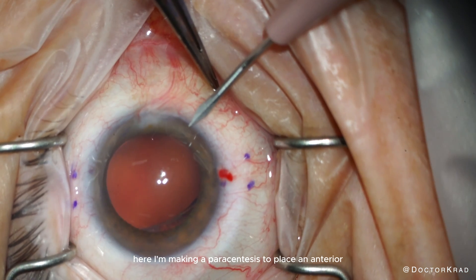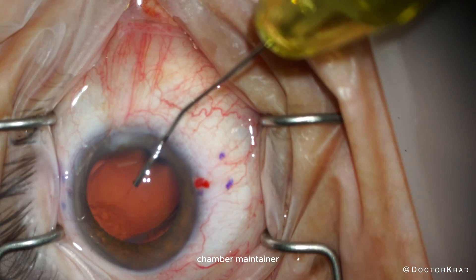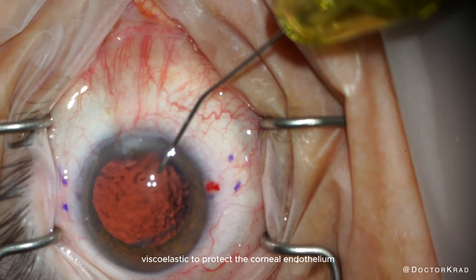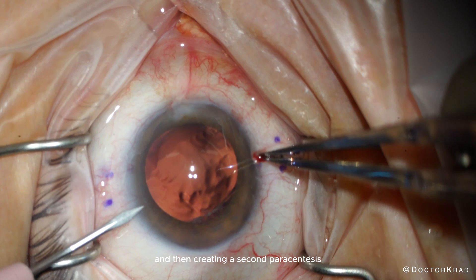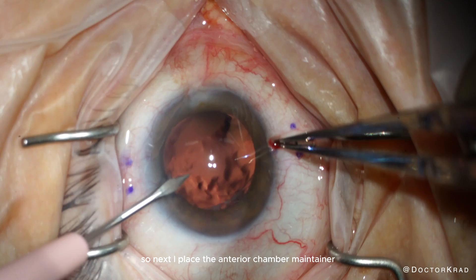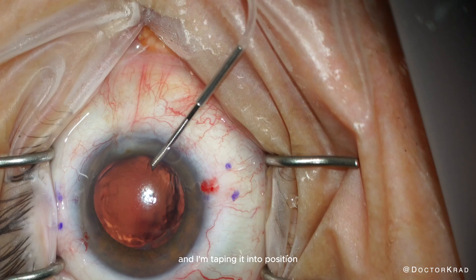Here I'm making a paracentesis to place an anterior chamber maintainer. I'm injecting some viscoelastic to protect the corneal endothelium, and then creating a second paracentesis to give me a different angle of access into the eye. Next, I place the anterior chamber maintainer and tape it into position.